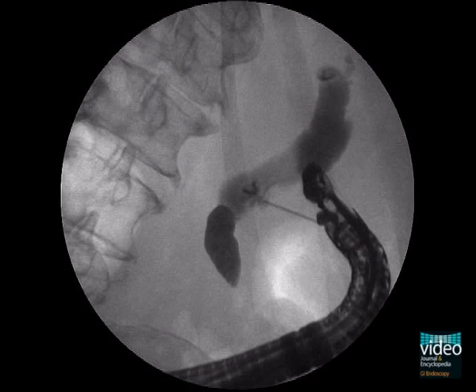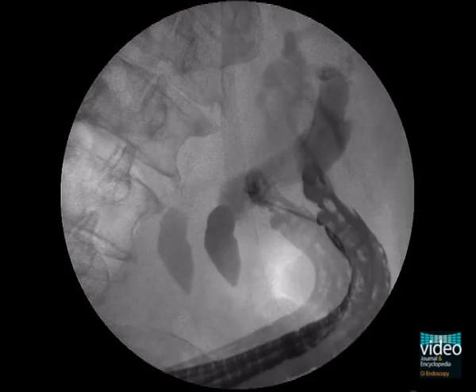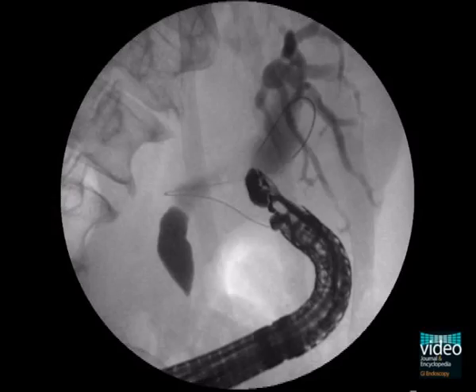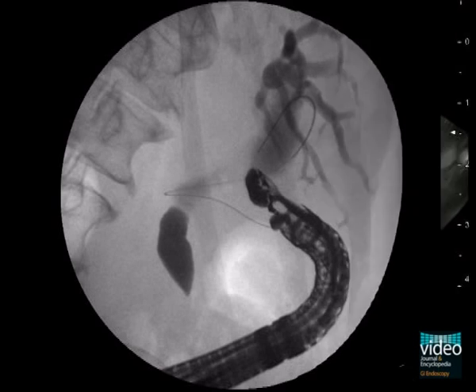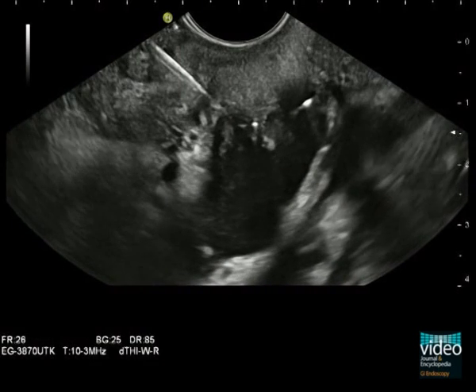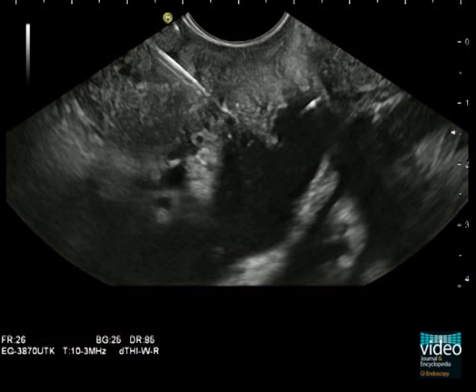Using contrast media, control fluoroscopy confirms the dilated bile ducts and absent bile drainage through the papilla into the duodenum. Under EUS and fluoroscopy guidance, a 0.035-inch guidewire is inserted through the needle into a bile duct. The guidewire should be introduced as far as possible into the intrahepatic branches of the biliary system.